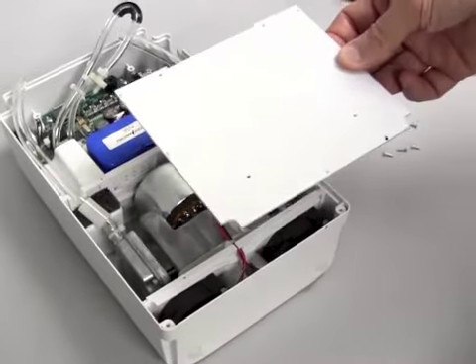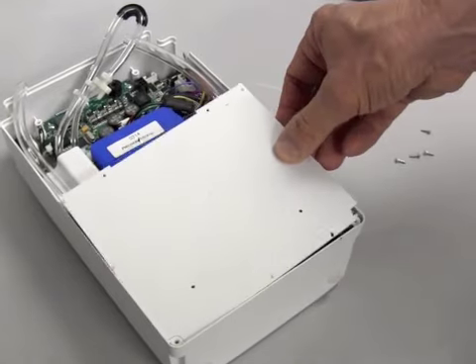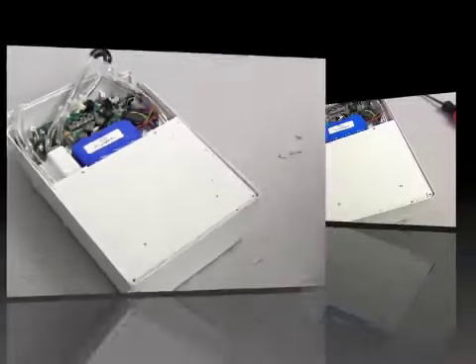All right, the next step is to place the cover for the compressor back in place and reinstall the 4 screws.